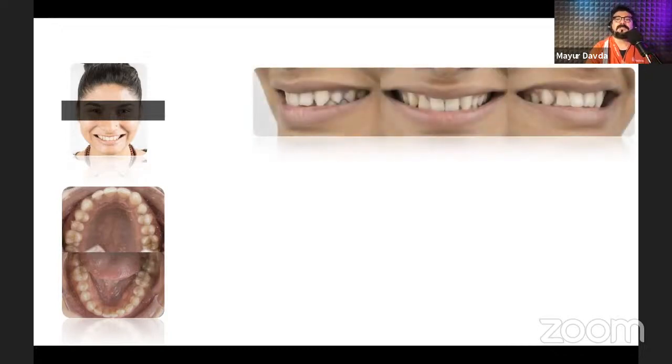So, what all pictures are required for the analysis of anterior aesthetic cases are full face picture, full arch occlusal images, and obviously close up smiling pictures. And not only a frontal smiling, which most of the dentists record, you have to actually record the lateral smiling pictures also, which a lot of dentists fail to record, and lateral smiling also of both the sides, which is extremely important for all the anterior aesthetic cases.